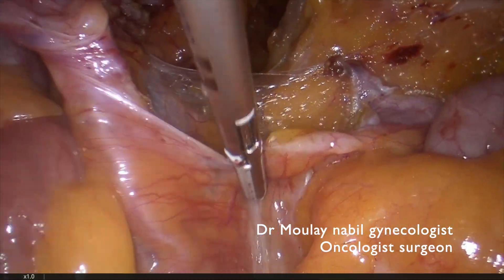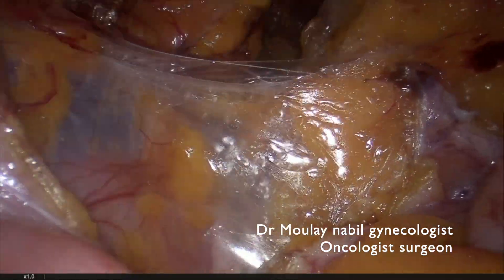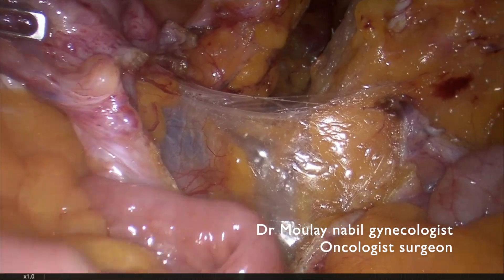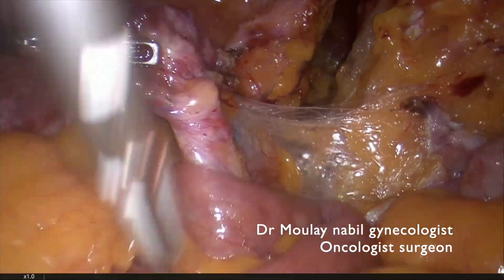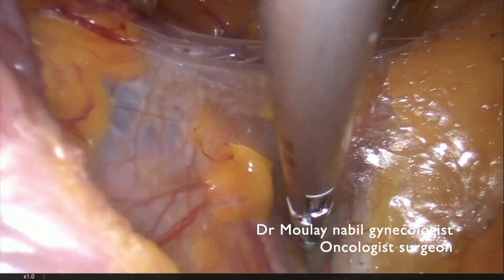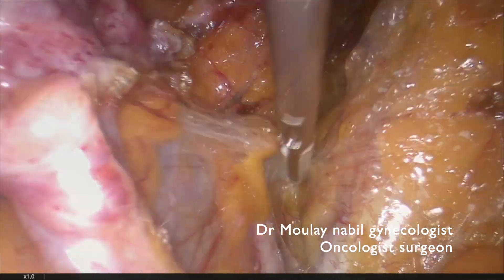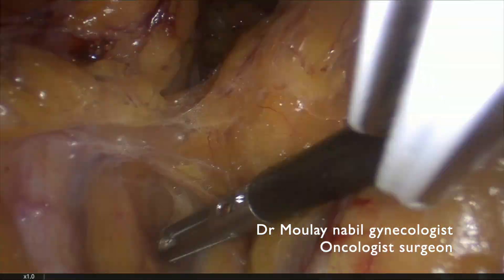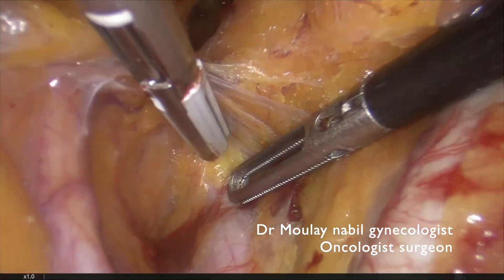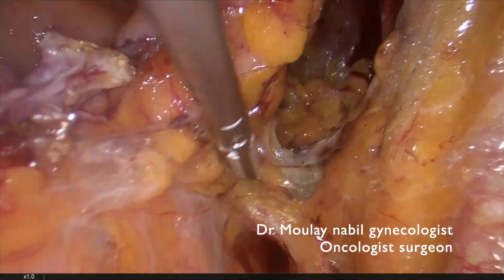The second step is the development of the pararectal fossa. For that we have to identify the ureter and we try to open the space lateral to the ureter, between the ureter and the internal iliac artery, which is the pararectal fossa.